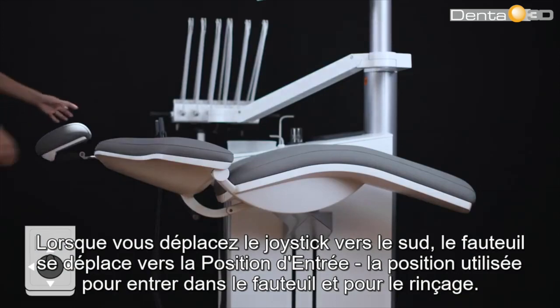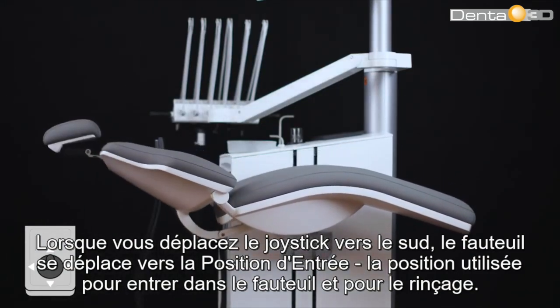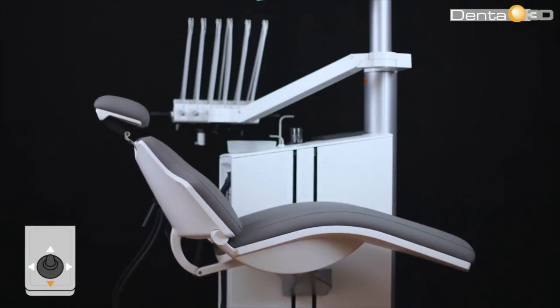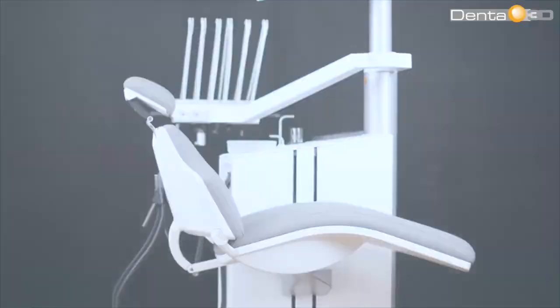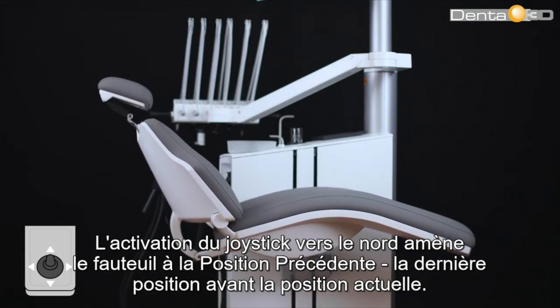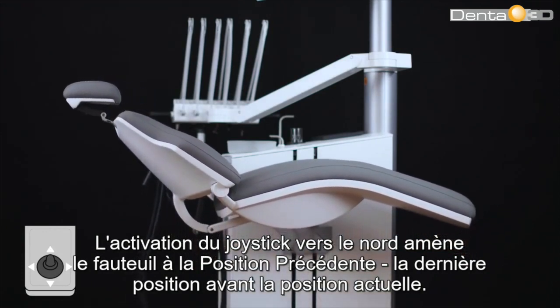When you move the joystick south, the chair moves to the entry position — the position used to enter the chair and for rinsing. Moving the joystick north brings the chair into the previous position, the last still position prior to the current one.